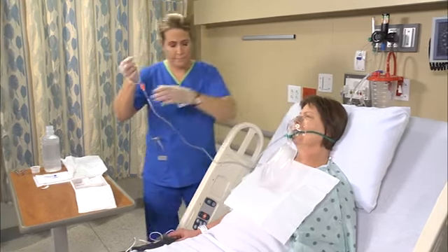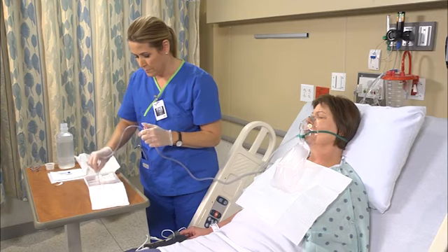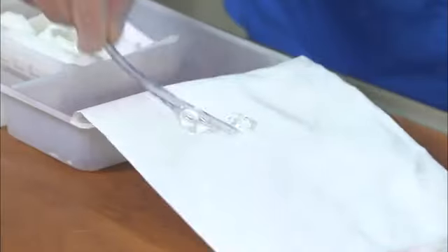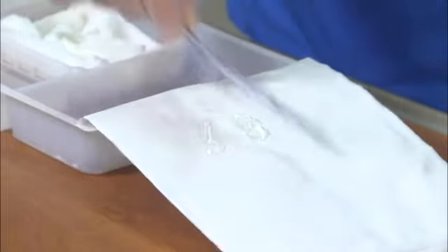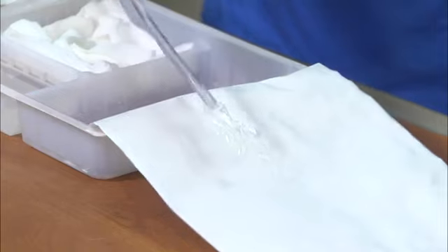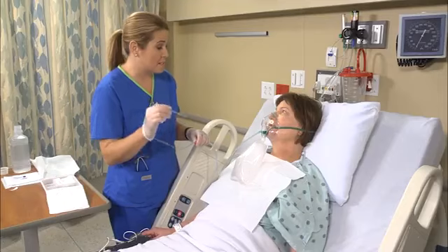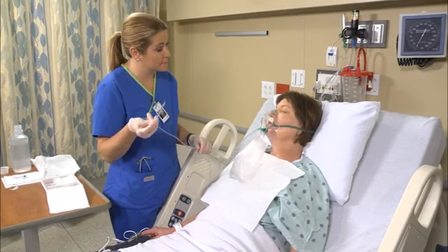Increase the patient's prescribed oxygen flow rate, instructing her to breathe slowly and deeply. Lightly coat 6 to 8 centimeters, or 2.4 inches to 3.2 inches, of the distal end of the catheter with the water-soluble lubricant. Miss Kennedy, I'm going to go ahead and suction down your nose into your lungs to help get out some of those secretions.